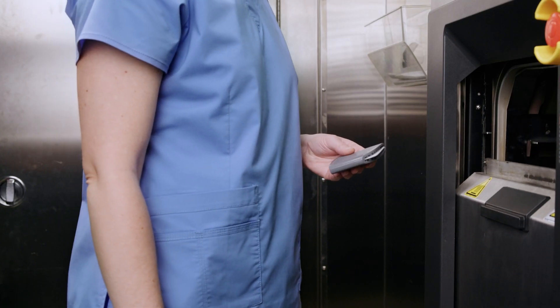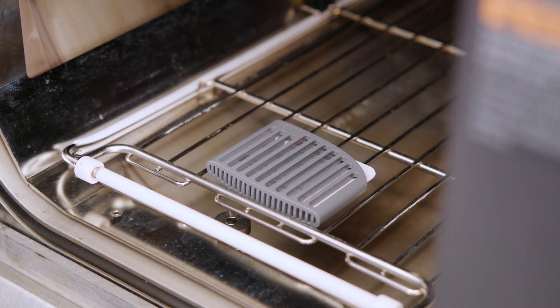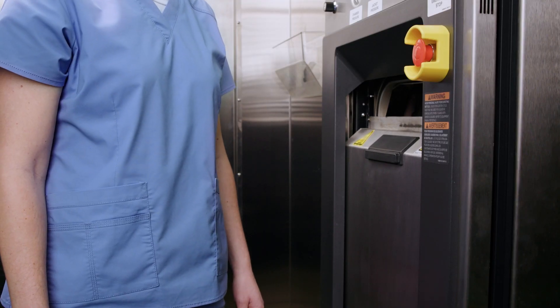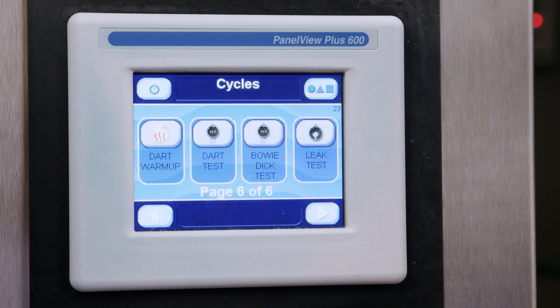Place the eBowieDIC test horizontally, label side up, on the bottom shelf of the rack over the drain in an otherwise empty dynamic air removal sterilizer and run your BowieDIC cycle.